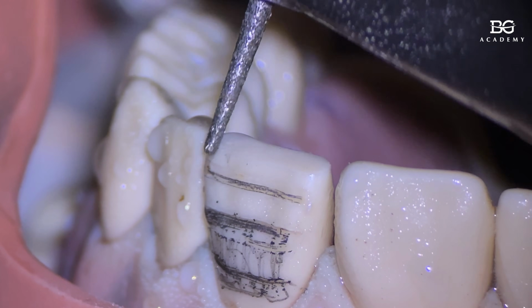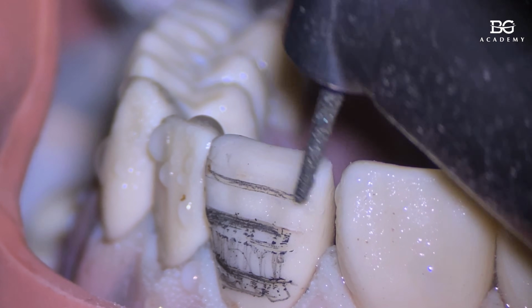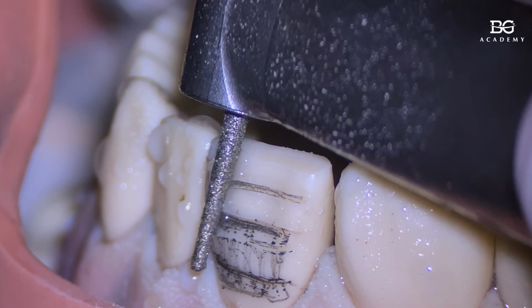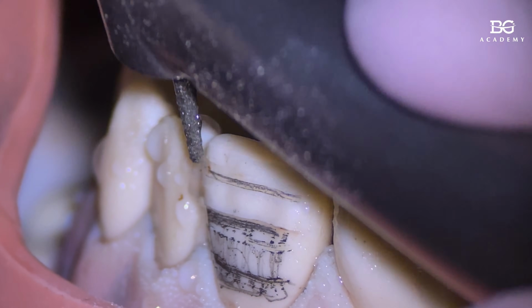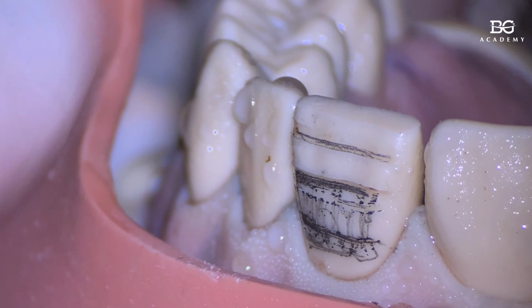You have to place the bur parallel to these 2 ribs. There is a groove in between, and there are 2 ribs. So I place my bur and I hold it parallel to these 2 ribs, and I will prep this area until this groove disappears. Okay?